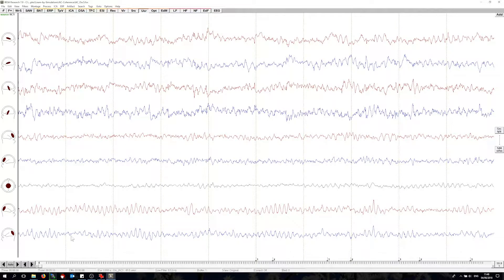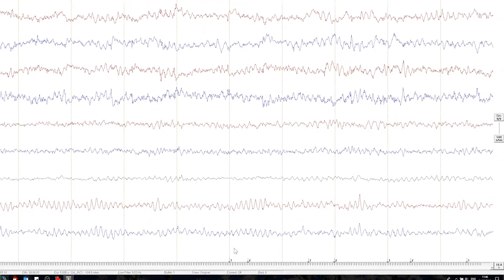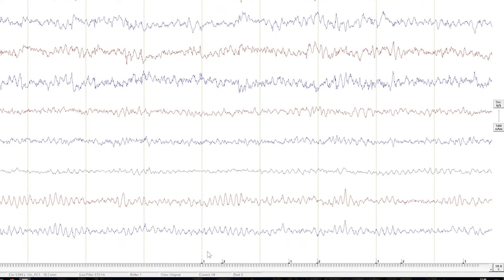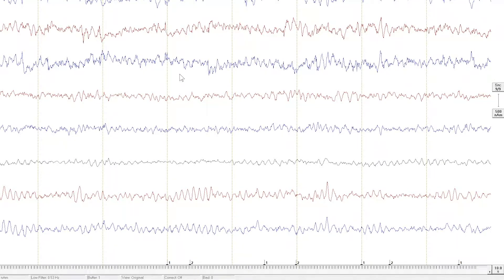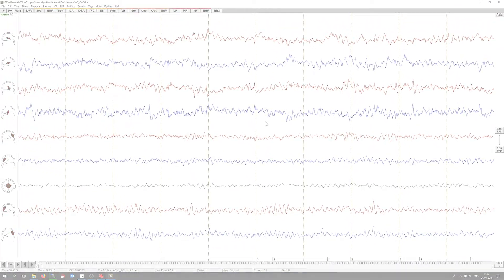You can see the stimulus events at the bottom. Trigger code 1 denotes the onset of an evoked auditory activation which is followed by the simulated oscillatory activity at varying intervals. The activity was simulated with a low signal-to-noise ratio and is thus not apparent in the non-averaged data.